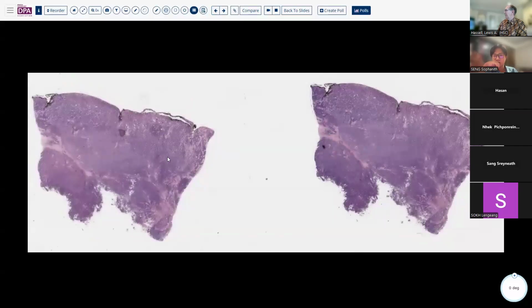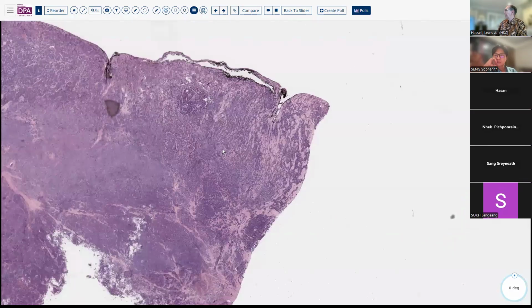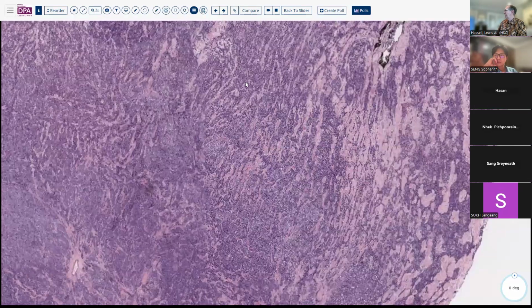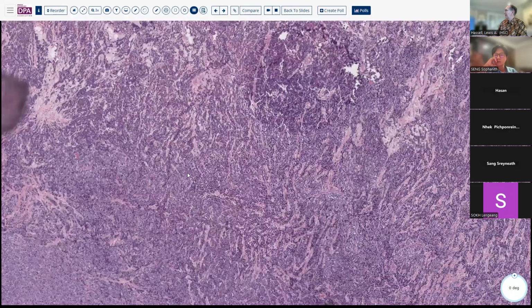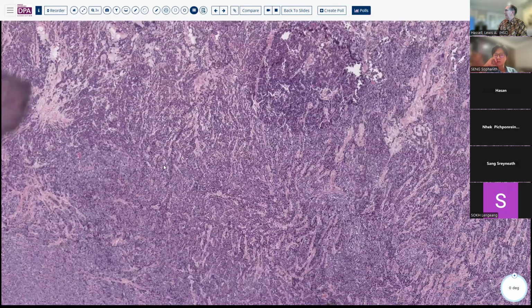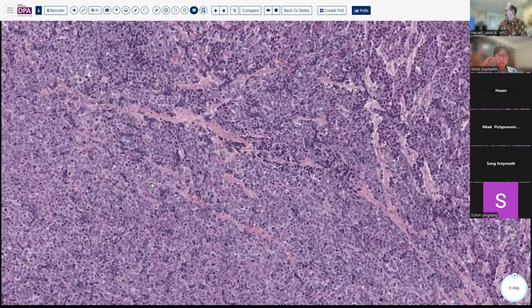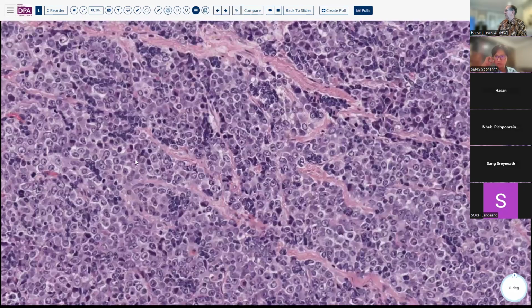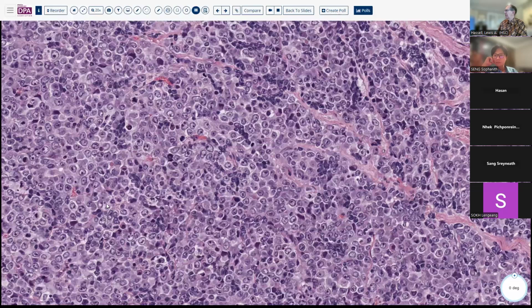Okay, here is another lesion and one that we should mention in the mediastinum, although it is most commonly seen in other areas. We do see it happening in the mediastinum. This is obviously a very high-grade neoplasm. As you can see, there's a lot of prominent nucleoli, a very undifferentiated appearance, this sort of amphophilic cytoplasm, and so forth. A very high-grade, undifferentiated carcinoma.